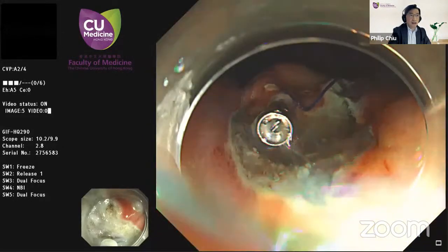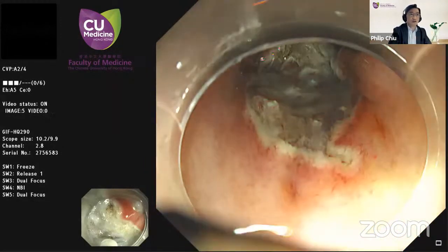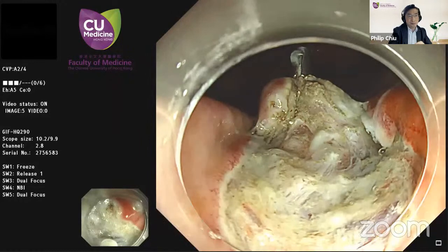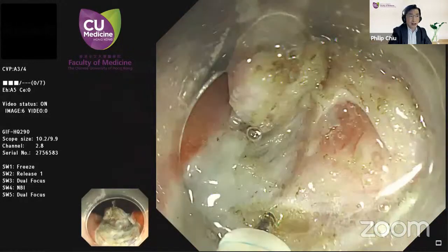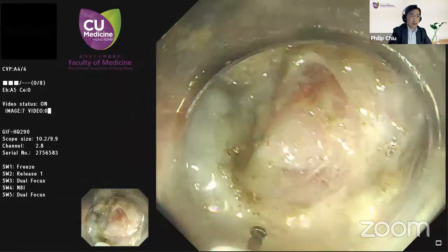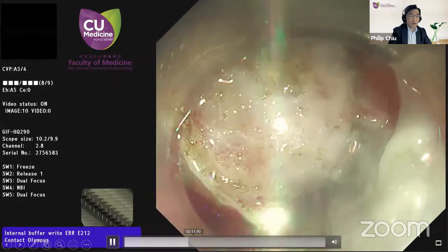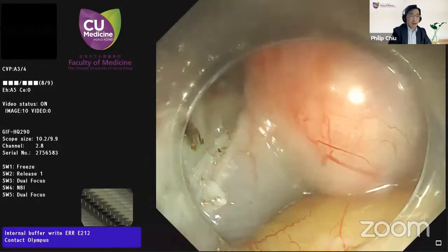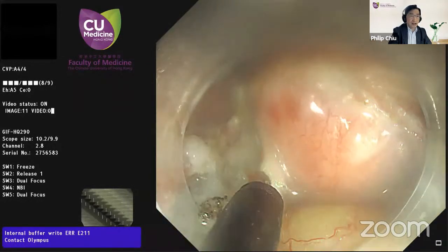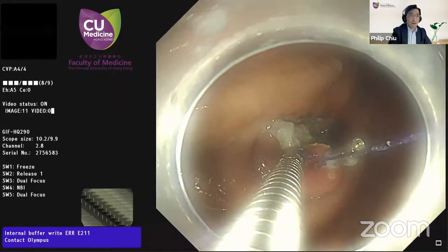So after applying this clip and line, which happens to be a surgical suture because I'm a surgeon, we retract and then expose the tumor here. So you can see now the tumor border. And sometimes we need to use different devices, for example, like using the IT nano. And now we are already inside the peritoneal cavity.